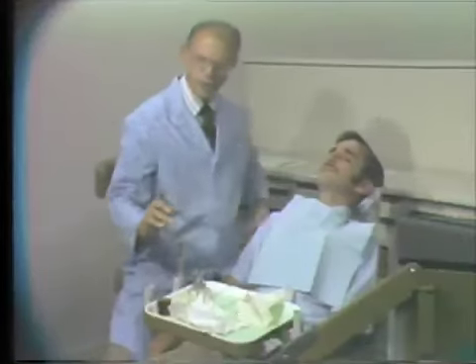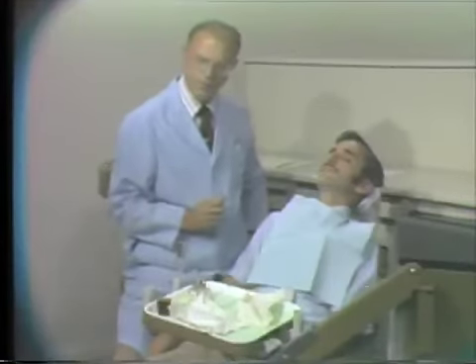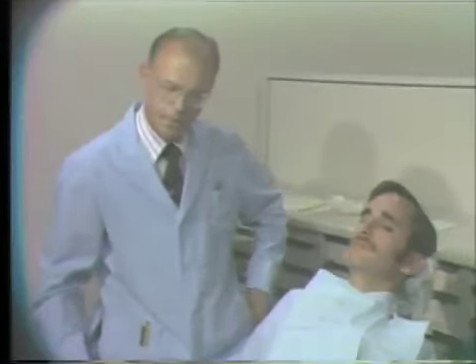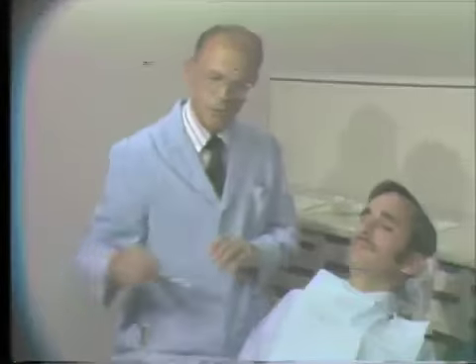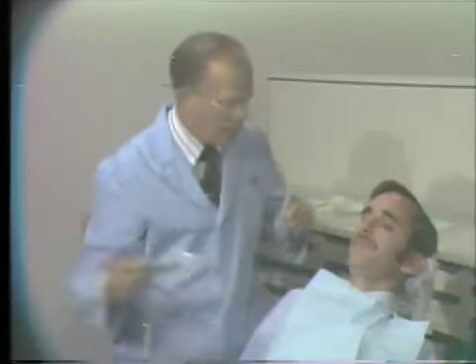It's important that these specimens be sent to the laboratory in as short a time as possible, that is, within a matter of a few hours. It may be necessary to incise and drain an abscess in the oral cavity for relief of the infection and the accumulation of exudate in the infection. At the same time this is done, it's possible to collect a specimen from the area for examination in the laboratory. This is done by, first of all, drying the area where the incision is to be made.